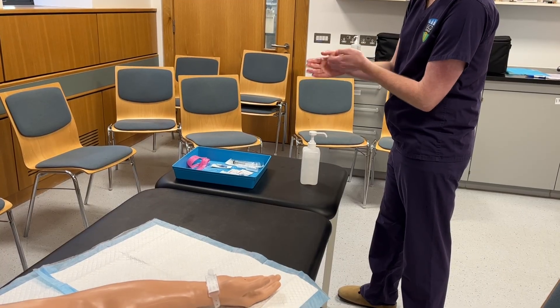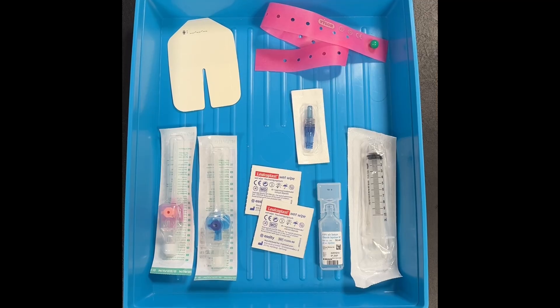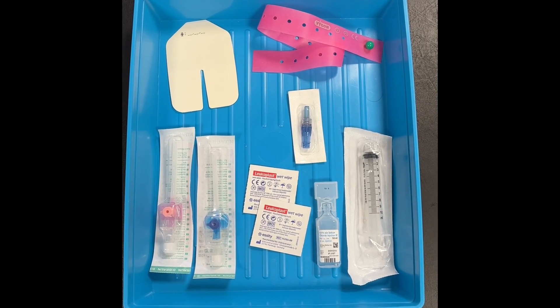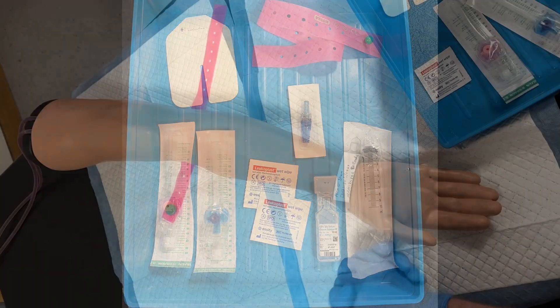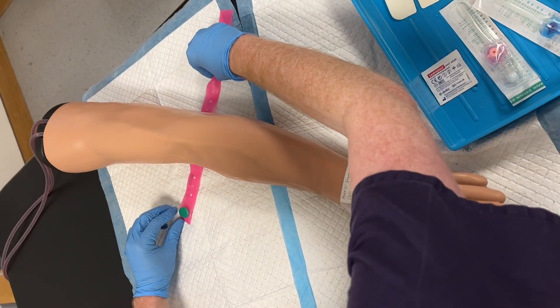This video will begin with a short demonstration and then a more detailed explanation. The equipment that you will need is shown here. Equipment may vary based on hospital, so it's important to familiarise yourself with the local equipment before you begin.